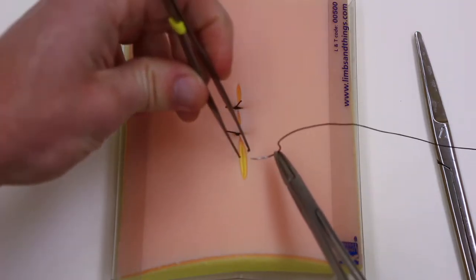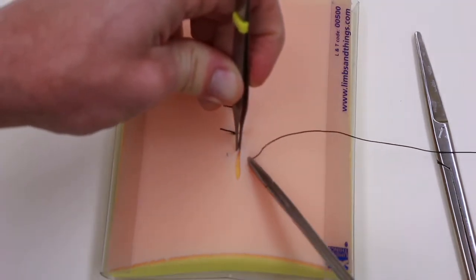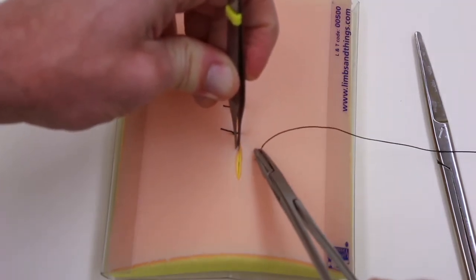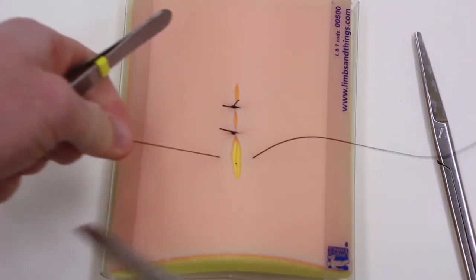One last one for demonstration here. Entering perpendicular to skin, following the curve of the needle, going across about the same distance. Sometimes you don't have quite enough needle showing. You can do a little pitch catch, throw a little more of the needle through.